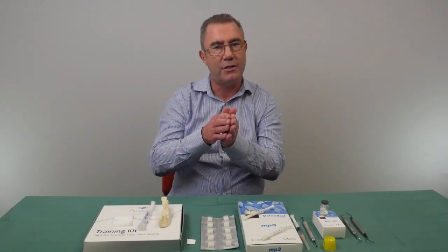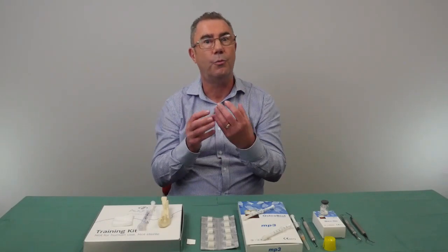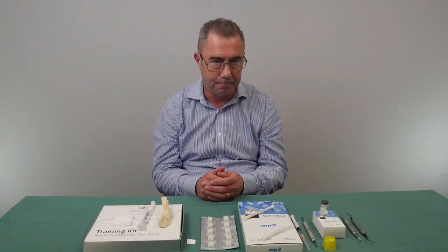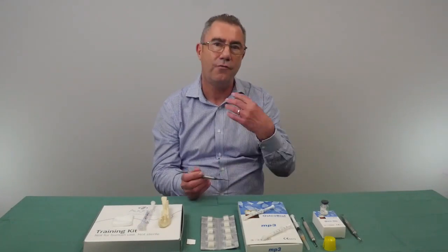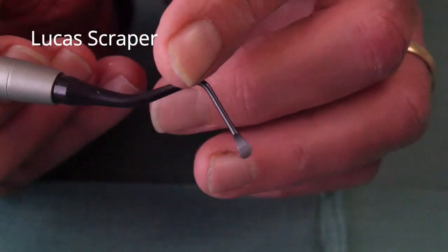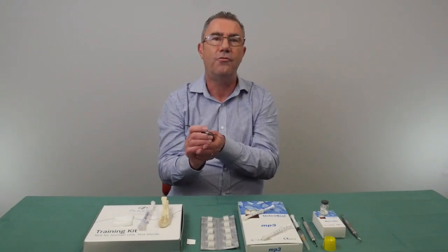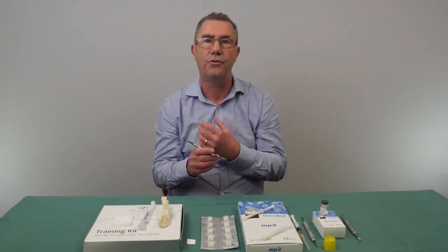This is important whether you're planning a later implant, a bridge — where it will give a better emergence profile for your pontic — or a denture, where it will give you more bone to help retain it. Immediately after extraction, make sure there's no infection at the bottom of the socket. A Lucas scraper is very important here — it's like an extended excavator that you pass down the socket to scrape out any granulation tissue or infection, and it also ensures good blood flow, which is important for socket preservation.